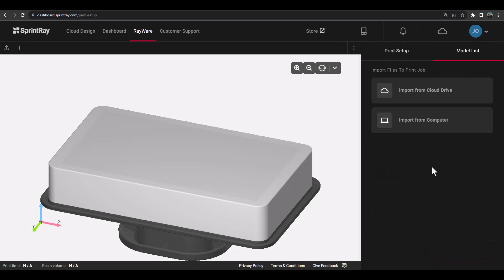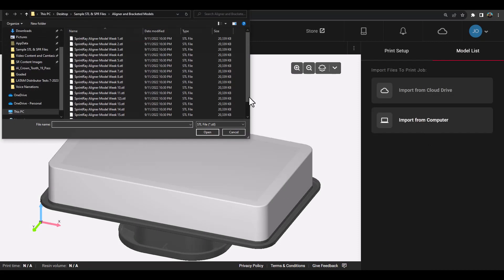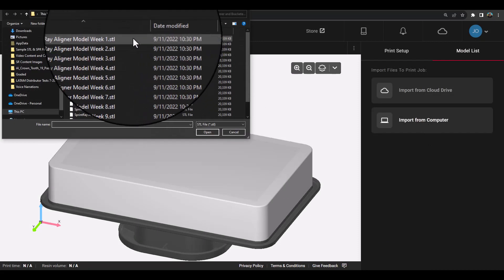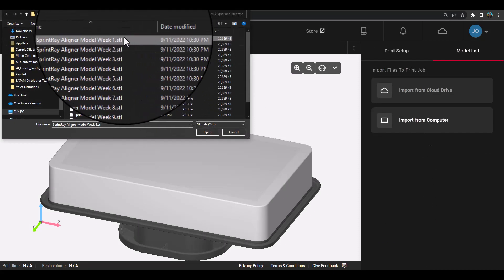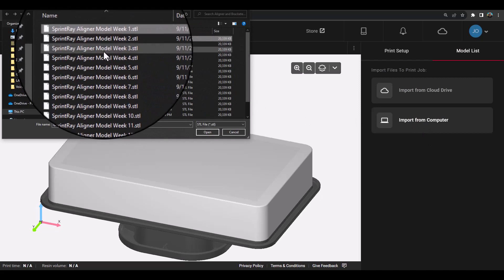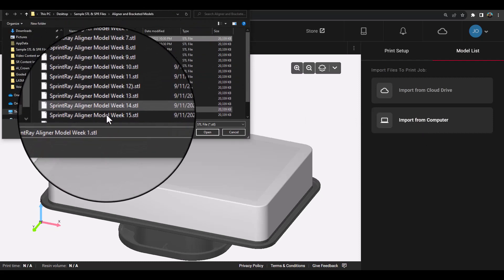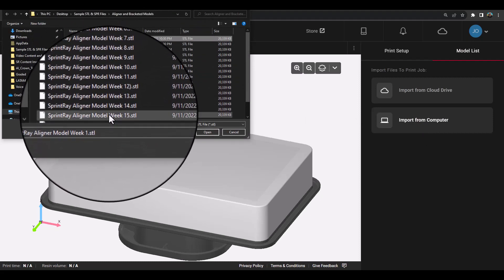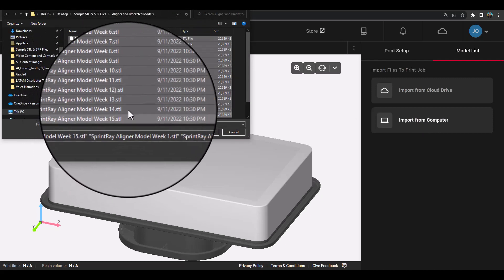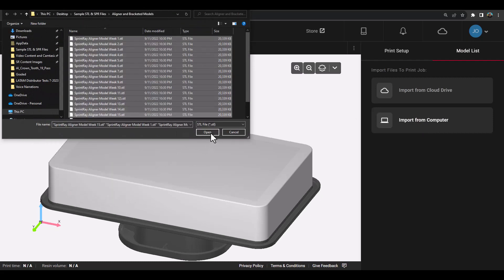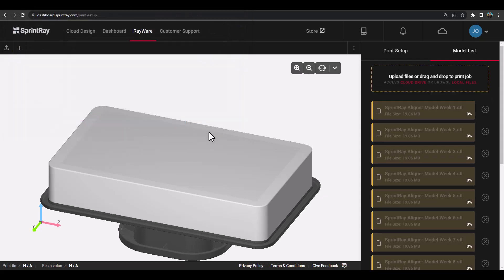Rayware Cloud also features automations such as model sorting and multiple platform creation for appliances like aligners that have multiple STLs and require multiple prints.